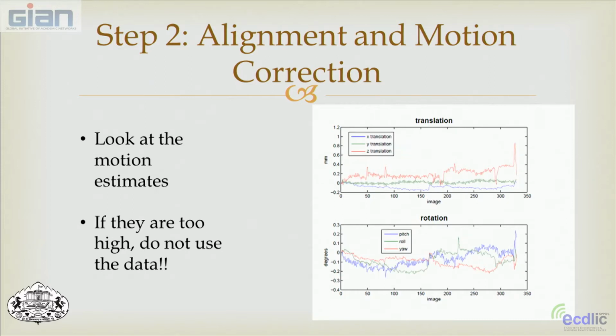People don't generally move in a straight 90-degree or orthogonal fashion. So if you're moving, sometimes you're tilting or going this way. A lot of times, as the participants relax in the scanner, they'll start to drop their head down more towards their chest. So we try to minimize this by making sure that they're comfortable and in a position that they think they can maintain for an hour when we put them in the scanner. So we tell them, make all your adjustments and movements now so that you're completely comfortable in a way that you can maintain for the next hour without moving about.